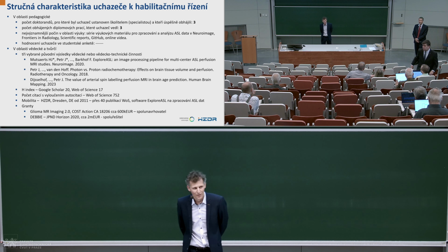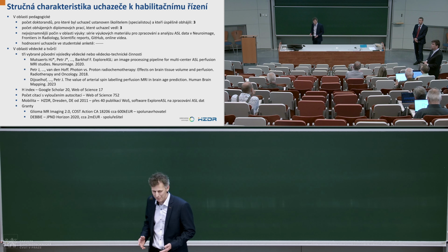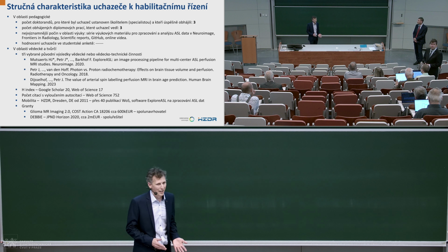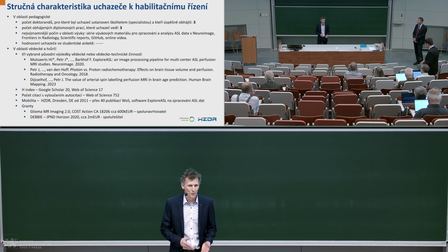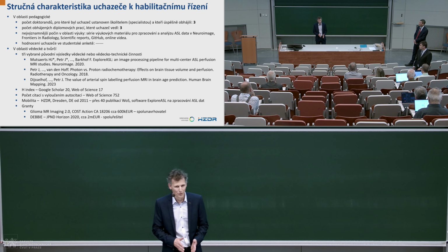I get your question. Sorry, that's a very specific question, so I'll answer to you. I'm not sure if all the others will be able to get it. So yeah, every method has its own drawbacks. The main advantage of using the same resolution to estimate the tissue components is that it is the exact same sequence. So you don't have any issues with the co-registration, deformations. It fits perfectly, and it brings a very nice image to it.